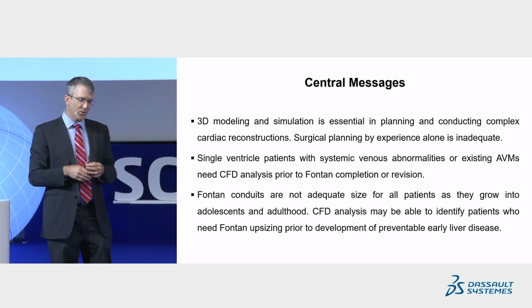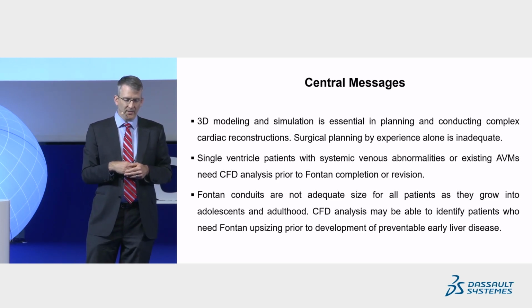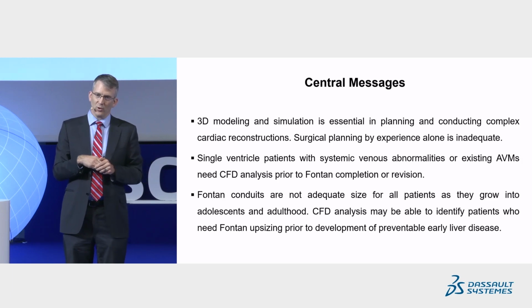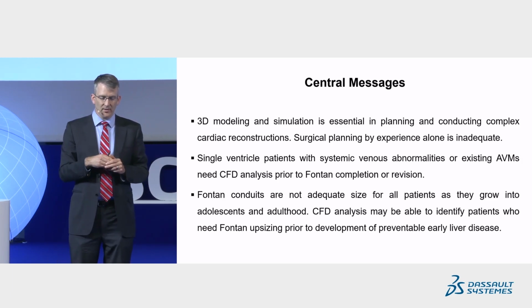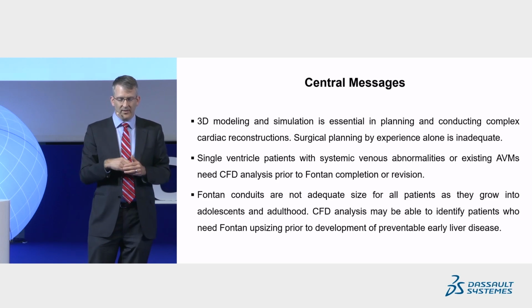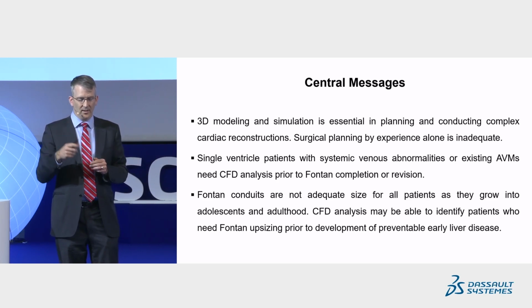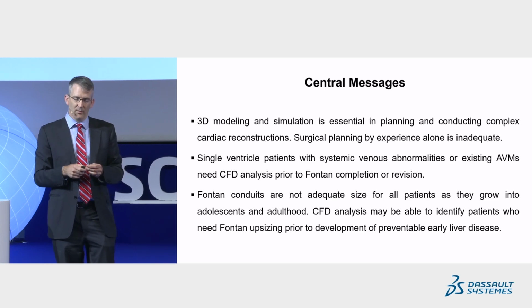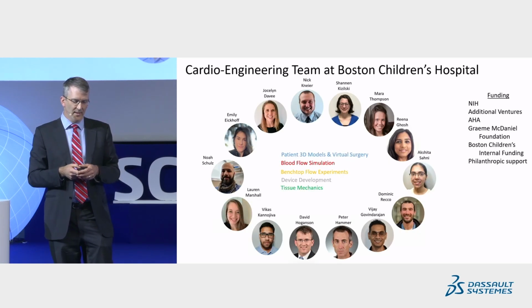So the central message is 3D modeling and simulation is really essential in planning and conducting complex reconstructions. Surgical planning by experience alone is inadequate. Single ventricle patients with systemic venous abnormalities or AVMs really need CFD. And Fontan conduits are maybe not adequate size for everybody. And CFD can help us understand who to upsize.